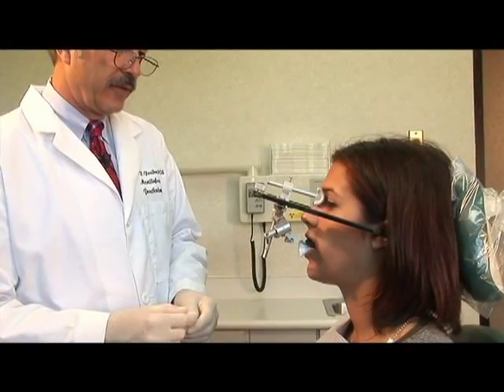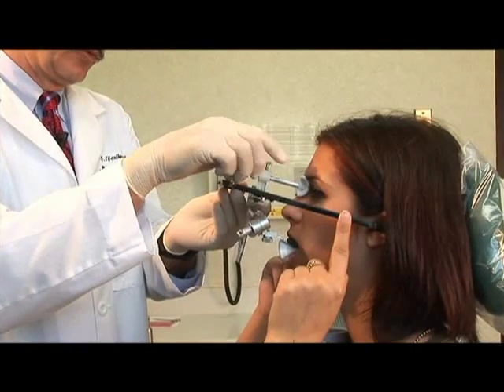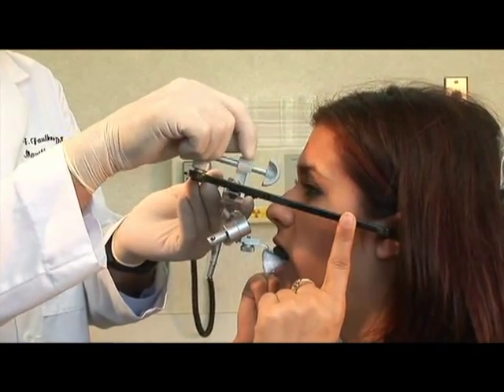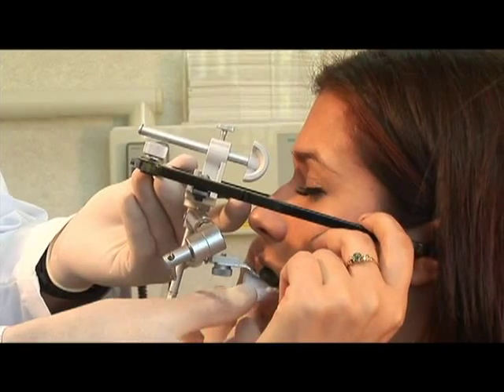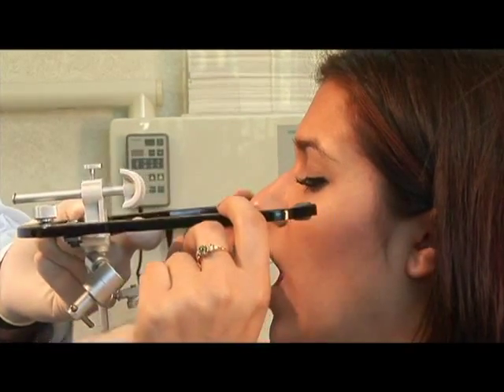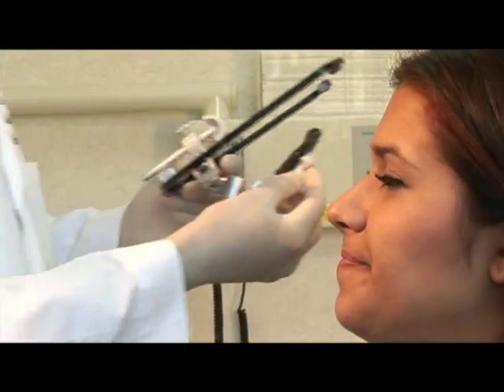Just hold on to the side of it. While the patient stabilizes the facebow, begin loosening the knob that was used to tighten the nasion. Next, loosen the center thumb screw on top of the facebow. The entire facebow assembly is removed by advising the patient to pull the earpieces out of the ears while helping to remove the bite fork from the mouth.